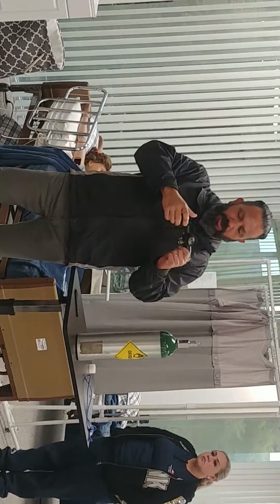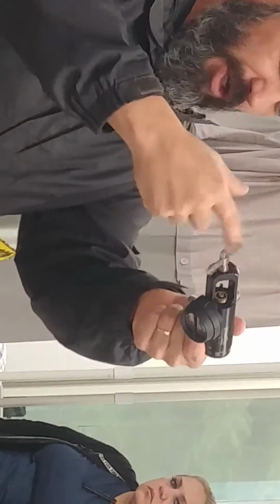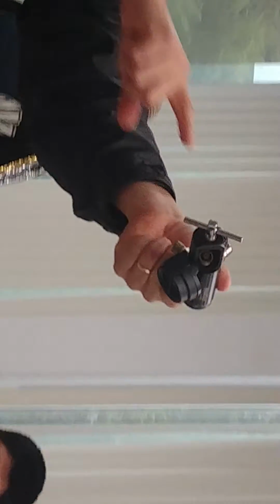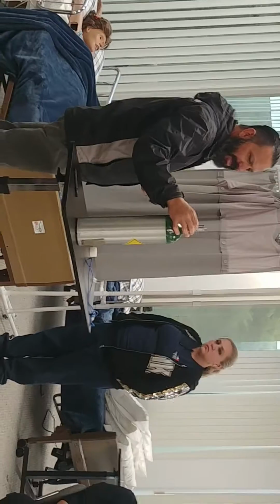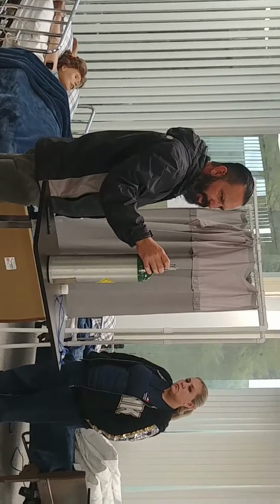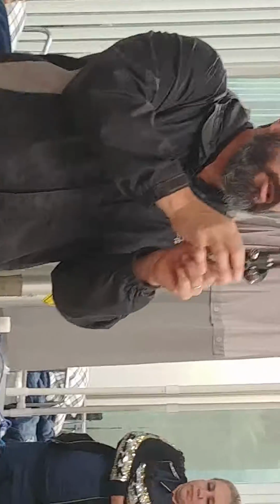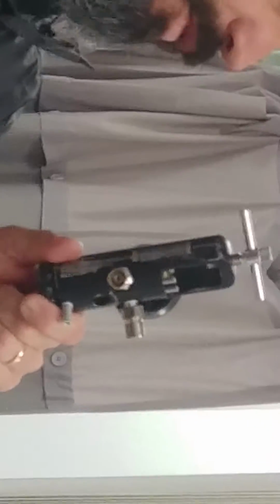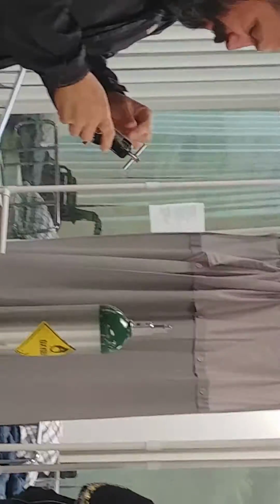Again, we have the yoke here that opens and closes, securing the device. If you notice the yoke, see right here how it comes to a point at the end. Does everybody see that? The reason for that is it's going to slide right into this portion right here, where we secure it in place, knowing that we're in the right place. Now we have these two portions right here. These are the prongs. Some people even reference them as fangs to help you remember. More importantly, there's a centerpiece right here.